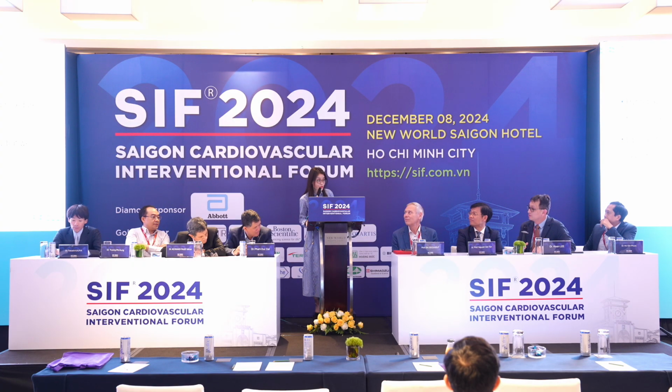There's just sometimes we have a lot of choice, to protect the OM or not. And I don't want to protect the OM first because we have to use a lot of wire and make it confused. That's why I'm confident that I can restore it if you lose it again.